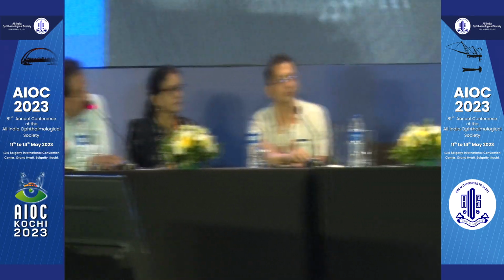Yes. Common situations like a non-dilating pupil, pseudoexfoliation. In those situations, Anurag, would you go ahead and do it? It's a wobbly bag. Absolutely, yes. I'll have to rule out the lenticular cylinder part. That's the reason why I showed it. Okay, yeah. That you're done, you're taken care of. So if that is not there and the corneal cylinder needs to be corrected, then obviously, yes, I would.